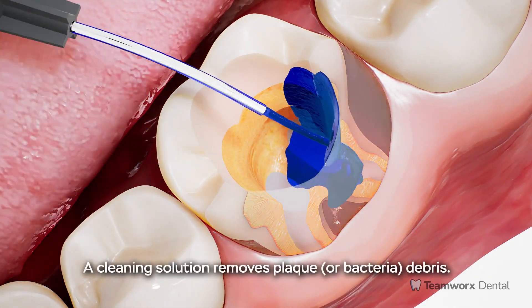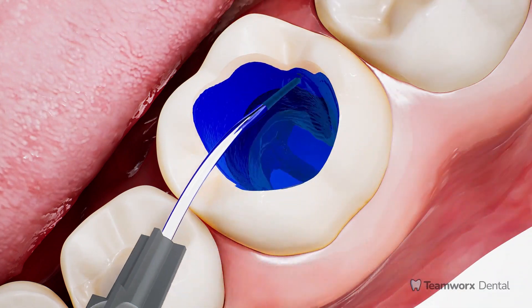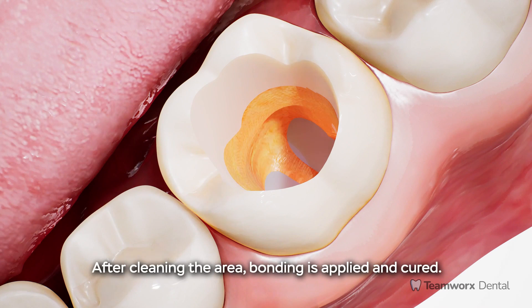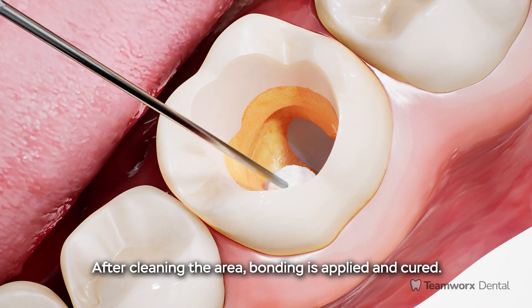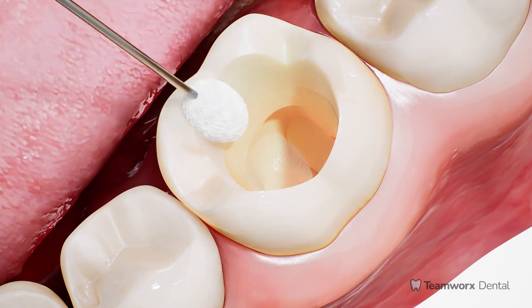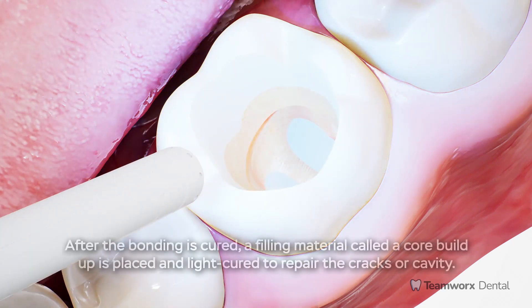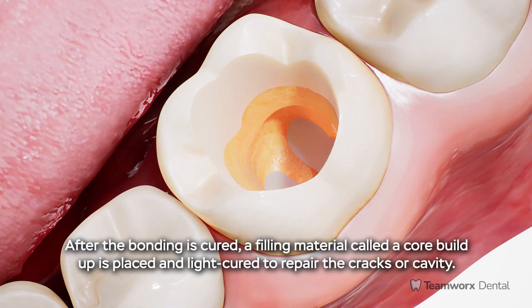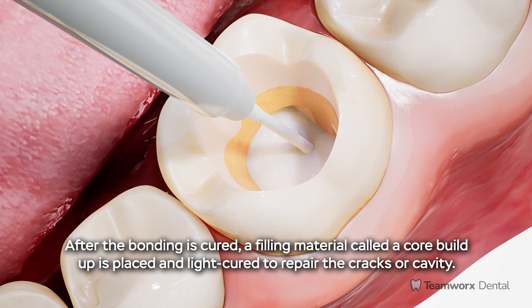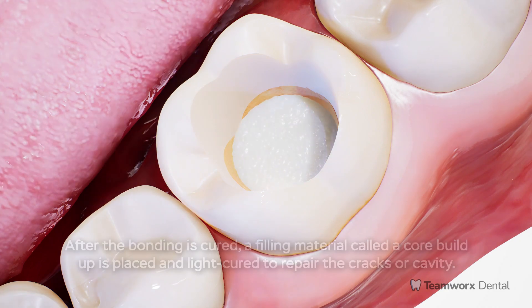A cleaning solution removes plaque or bacteria debris. After cleaning the area, bonding is applied and cured. After the bonding is cured, a filling material called a core buildup is placed and light cured to repair the cracks or cavity.